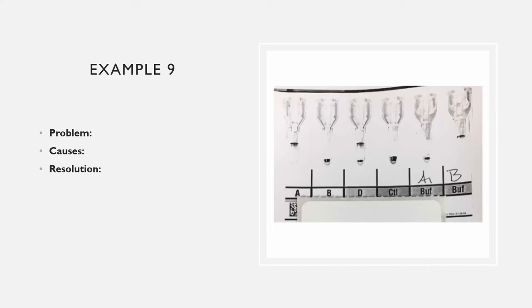Some anti-D are D blends. So in your rack, if you look at your anti-D, some will say D blend, some will say monoclonal, some will say polyclonal. We'll talk about this a lot more next week. I love the Rh system, so I will talk about it all day if you ask me to.